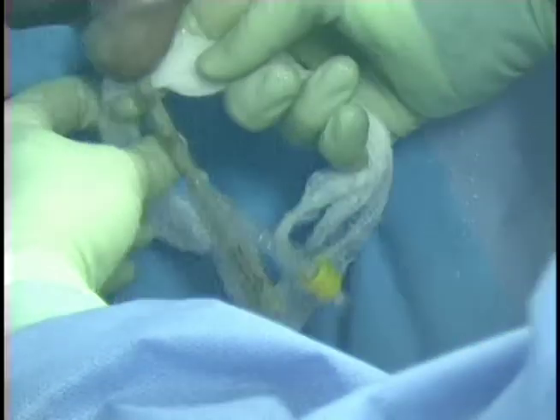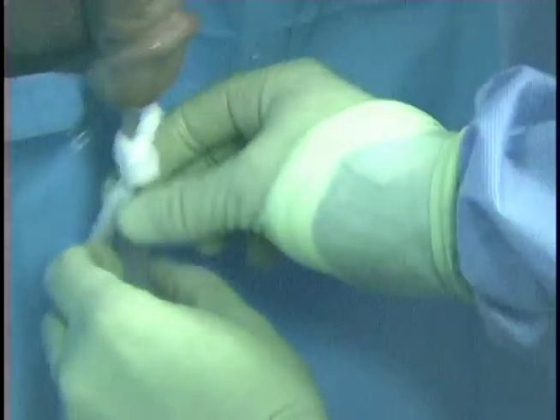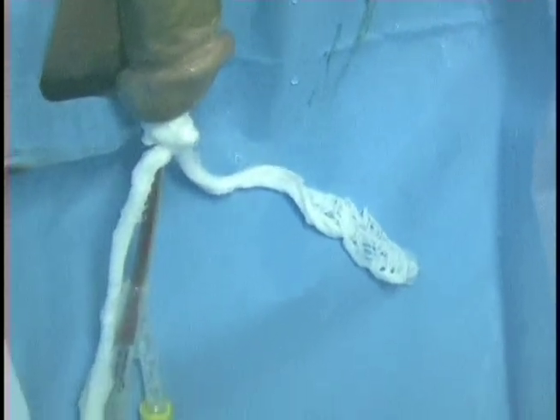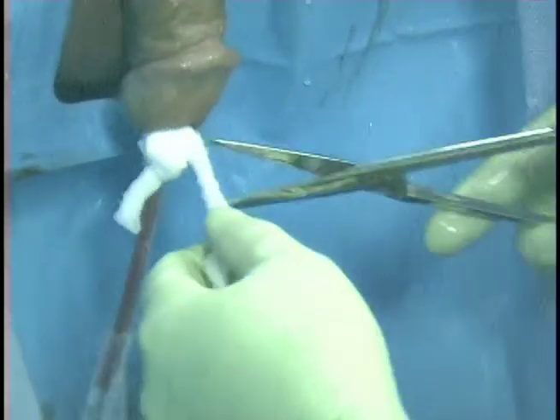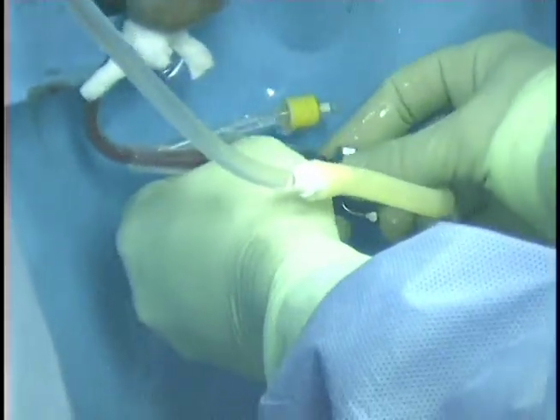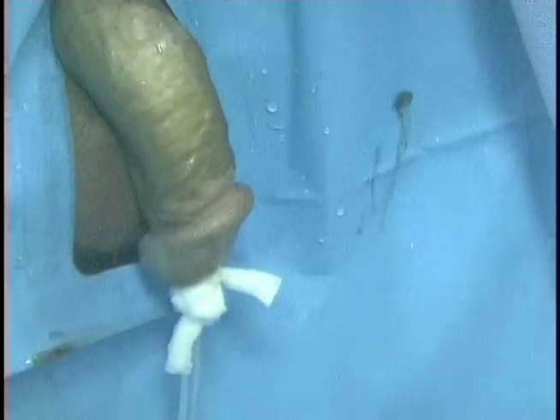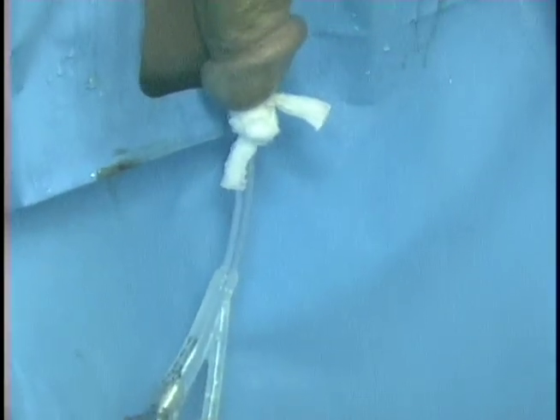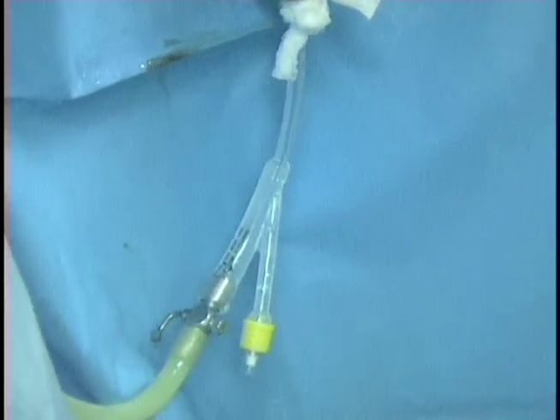We now demonstrate the placement of the traction knot. A wet sponge is wrapped around the catheter, tied into a strong knot, and then brought up to the glans penis simply to provide capillary-like compression. We know that the type of oozing that occurs after the surgery is more capillary and more venule versus large venous or arterial, just due to the hemostatic properties of the green light laser. So as such, some gentle traction with a 30 cc balloon against the bladder neck is all that's needed in the recovery room to clear things up.